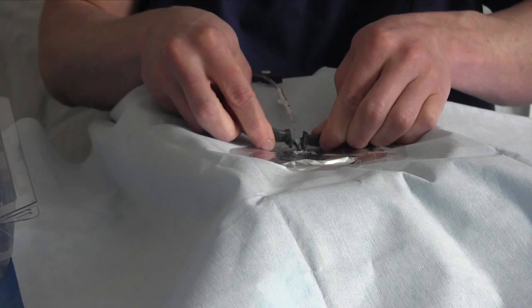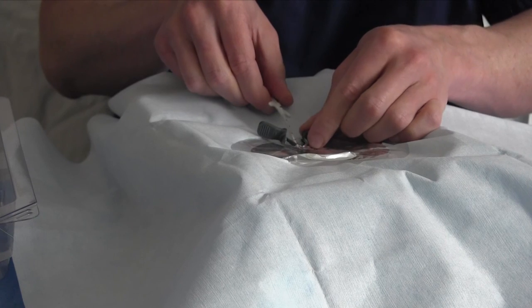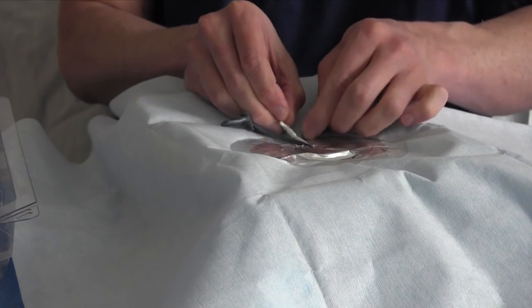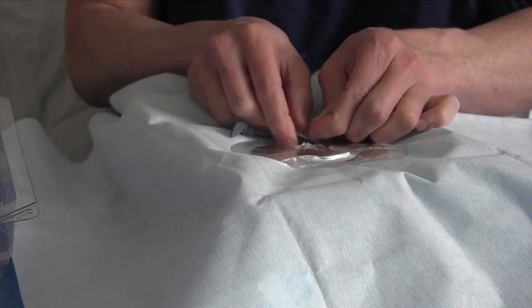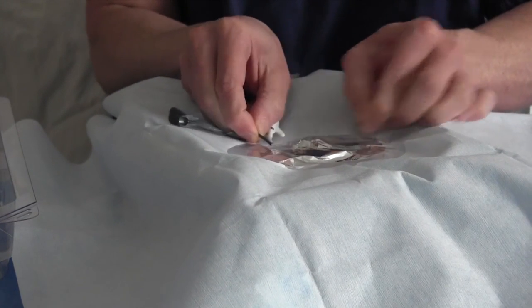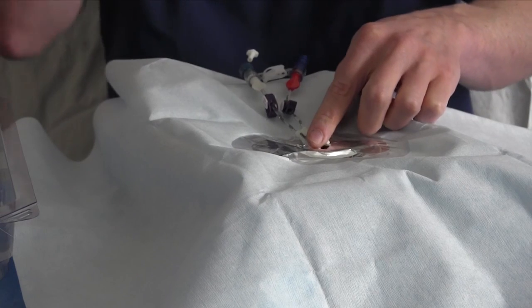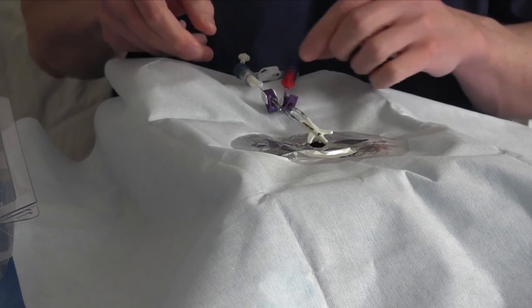It just breaks in half. And I'm going to spread the dilator with the portion I'm spreading out of the skin. And then pull more of the dilator out, spread, pull more of the dilator out, spread, pull more of the dilator out. And this way, I'm not breaking the dilator inside the patient's body. I'm breaking the dilator out of their body. And then advance and spread until the dilator is all the way out and broken. Get rid of that. And then I'll advance the last portion of the midline in so that it's hubbing at the skin. Okay, what now?